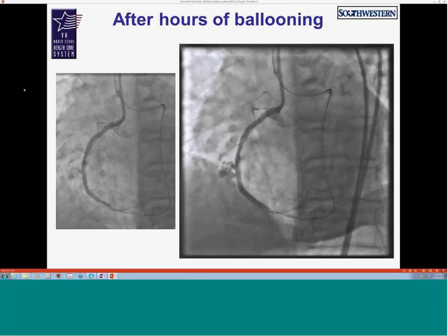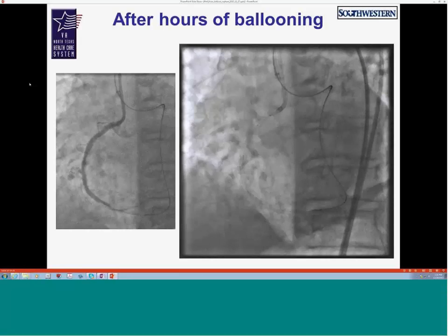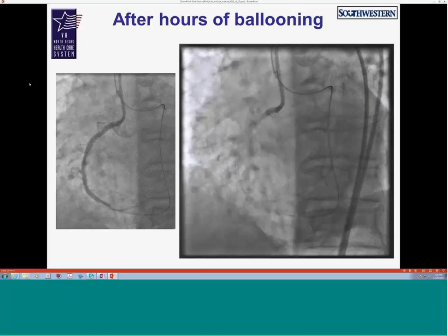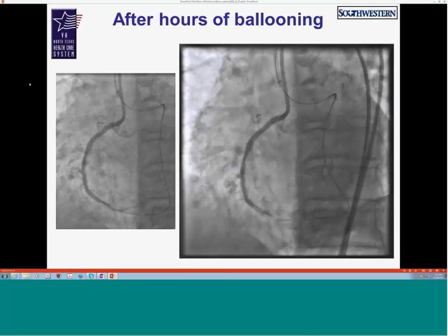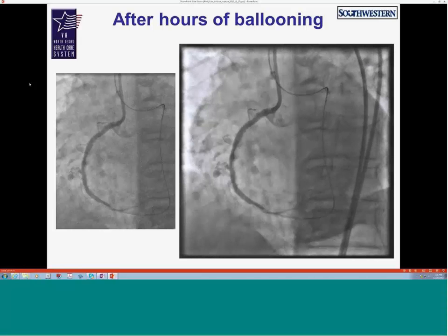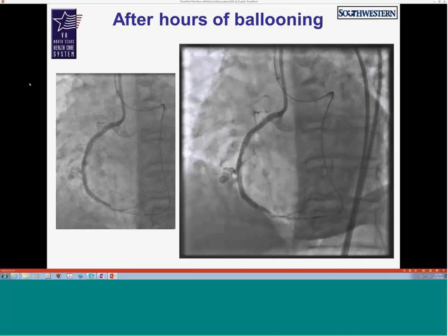I would also second this issue about dealing with reversal. We had a case with a perforation where we reversed, and it was really terrible trying to get rid of all that clot that developed after that. So once you commit to reversing, you really have to anticipate that thrombus might develop. Yeah, that's a good point, and again, especially with an externalized wire. So after I reversed, I removed the wire from the LAD and left main so we don't have any clotting off there. If you close it, maybe not as horrible, but if you close the LAD, obviously, that's going to be pretty catastrophic.